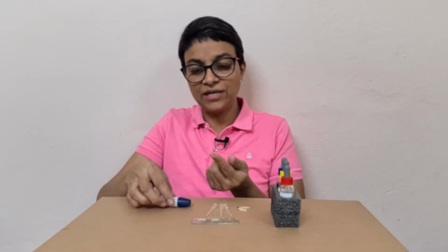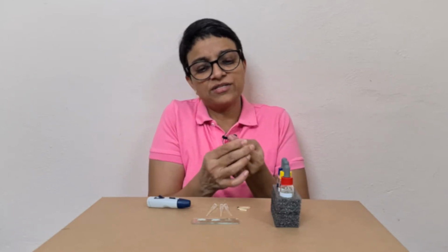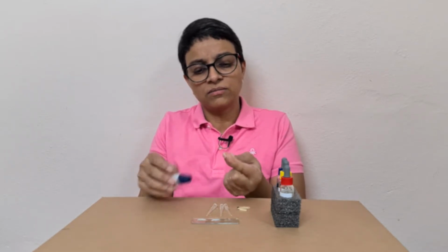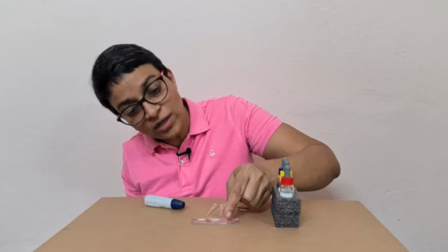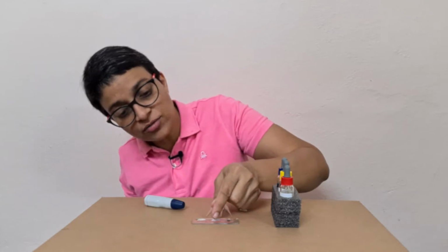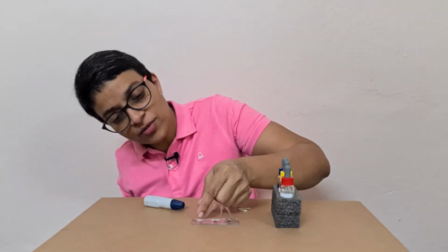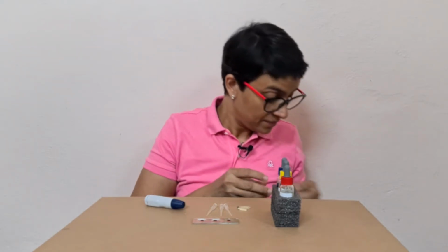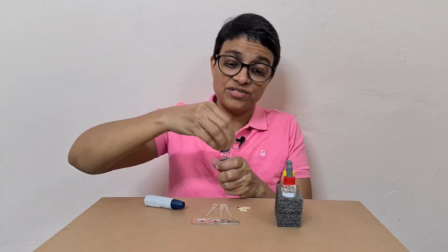Now, before we prick, we have to try and get the blood to the fingertip because we have to fill 3 cavities with it. Then you take a gentle prick. In cavity 1 you put 1 drop, in cavity 2 you put another drop, and in cavity 3 you put another drop. That is, we are testing both for AB and RH in the same test. I will tell you whether I'm A positive or B positive or O positive, negative, whatever.